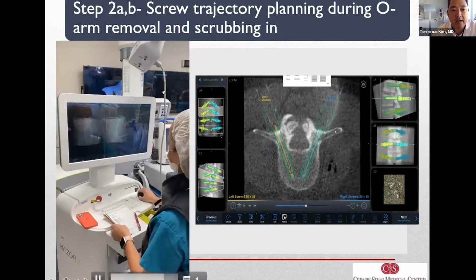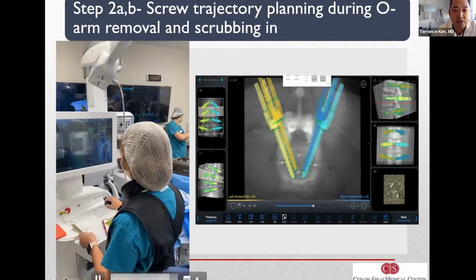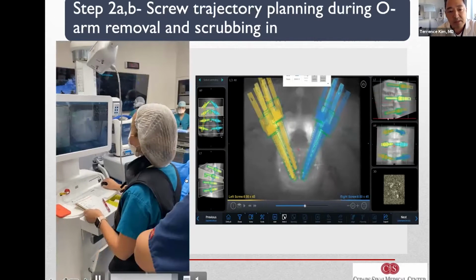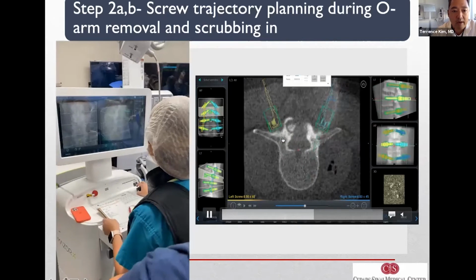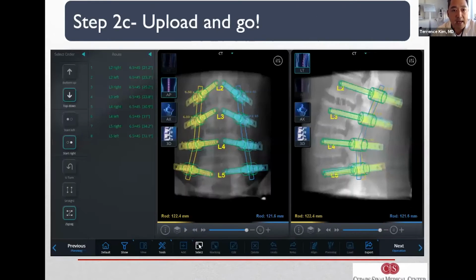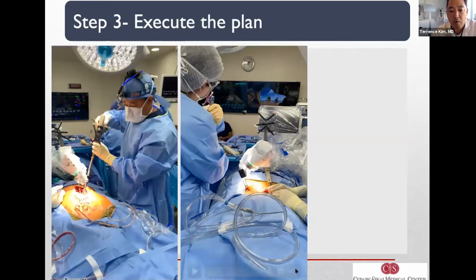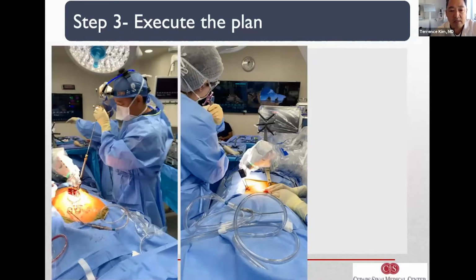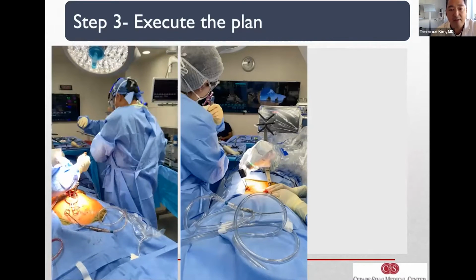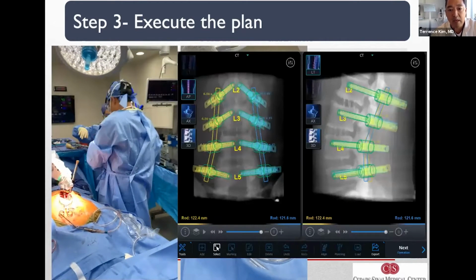This is George Hanna, now our newly minted partner, but our spine fellow usually comes in, scrubs in and starts getting the patient prepped, takes the drapes off, calibrates the instruments. And so this is all happening in a very coordinated fashion. Surgeon checks the final plans. We upload the images to the robot. And then step 3 is the execution. Basically understanding what we're working on on both sides. We have the plan all set. The navigated robotic arm really does cut down on the fiddle factor, which we used to have with navigation, about the ideal trajectories. And ultimately what we plan is what we get.